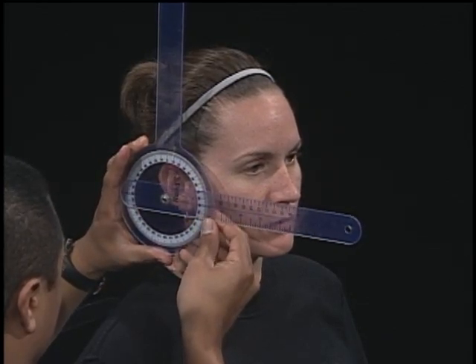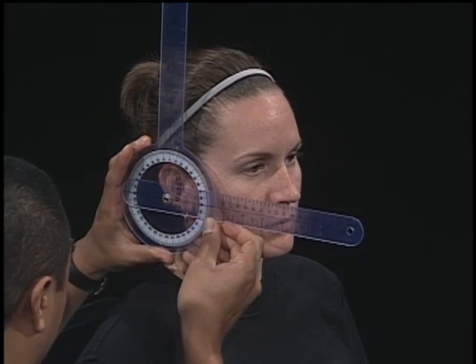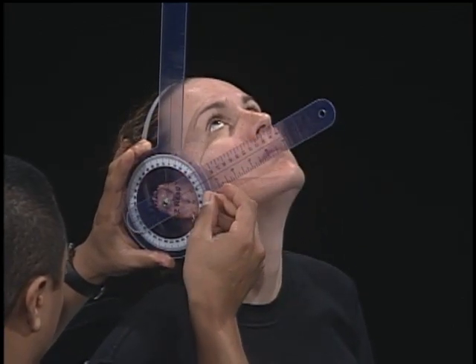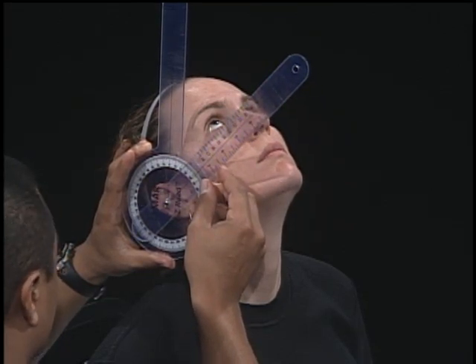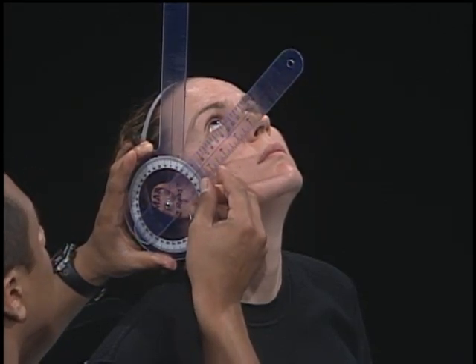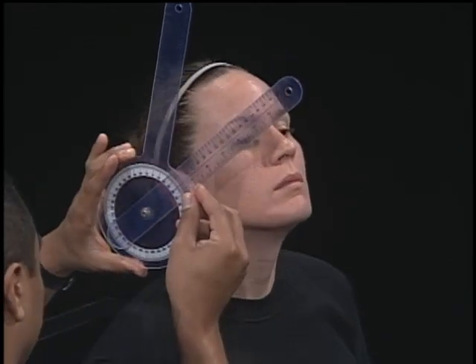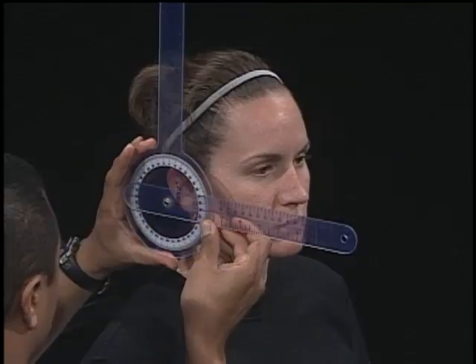Ask the patient to perform cervical extension as done previously, maintaining the goniometer in alignment through the entire range of motion and observe for any extraneous movements of the trunk. Read the degrees of motion on the goniometer and then ask the patient to return the head to the starting position. Remain at eye level of the goniometer when reading the measurement. Make a note of the amount of degrees measured.